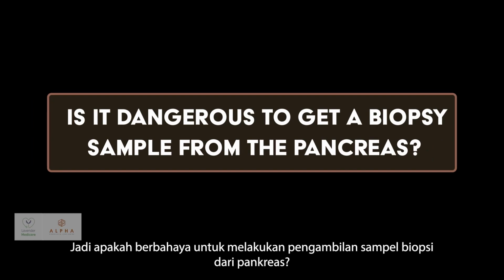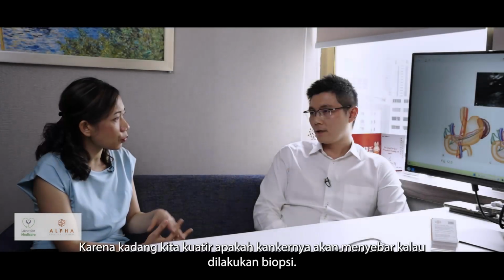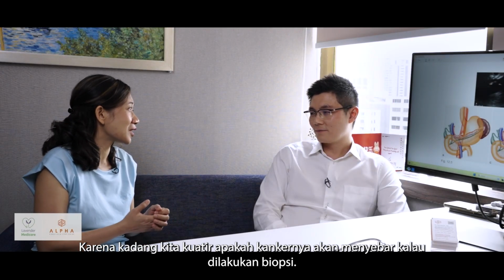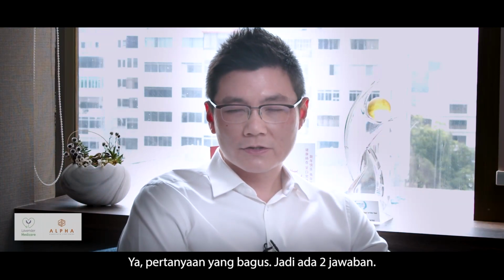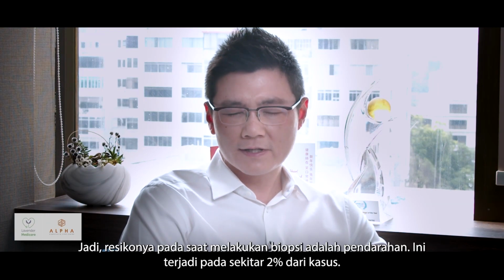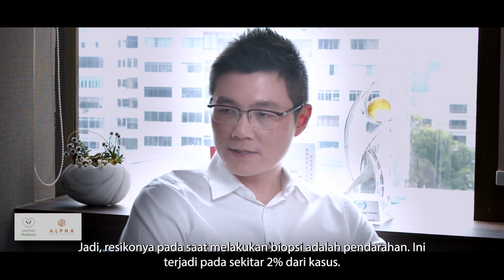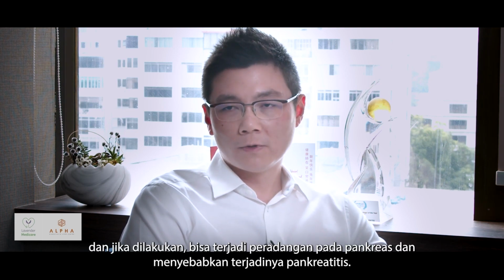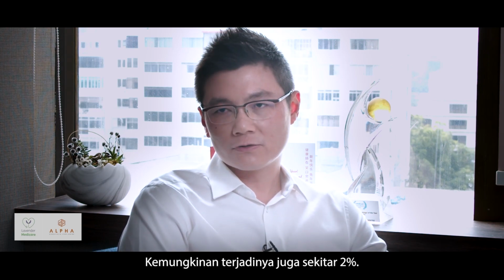So is it dangerous to get some biopsy sample from the pancreas? Sometimes we worry about the cancer will spread if you do biopsy and things like that. Yes, that's a good question. So there's two answers. The risk, mainly if you biopsy the pancreas, will be bleeding. It happens in less than 2%. And if you go through normal pancreas, the pancreas can get inflamed, you can get pancreatitis. Also happens in less than 2%.